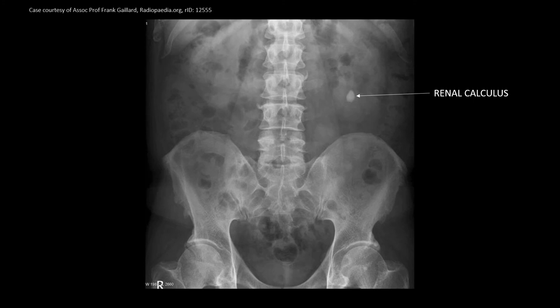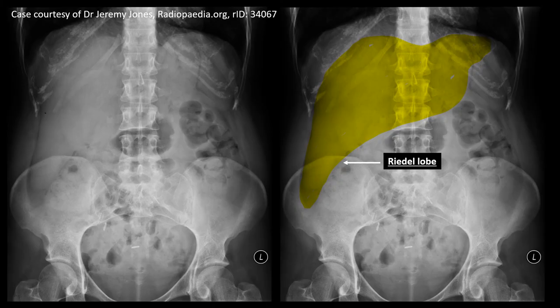Sometimes we can see such calcified structures in the abdominal X-ray. In some conditions, the lower margin of the liver extends downward. Although this may be normal, this extended lower margin of the liver is known as Riedel's lobe.